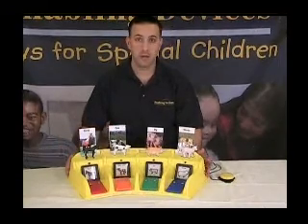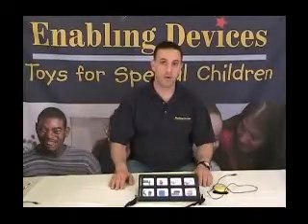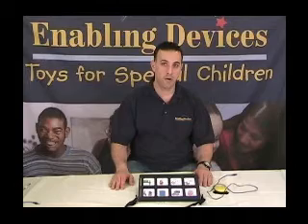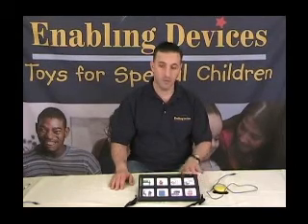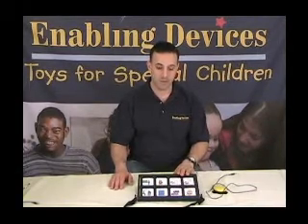That concludes the setup on the scanning capabilities of this machine. Now we're talking about our Talk 8, number 2501 with levels. This is a 12-level communication device with scanning capabilities. It actually has four modes of scan, and I'm going to go over each one of them.